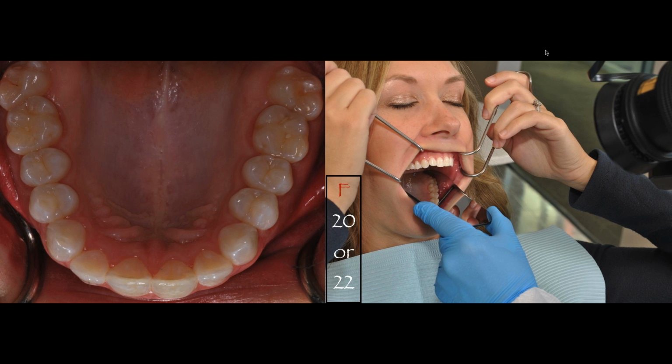And you see me right there. Look at the angulation. I'm standing up. The patient is seated all the way up. And this is the photo that we obtained from that position, and with that f-stop right there.